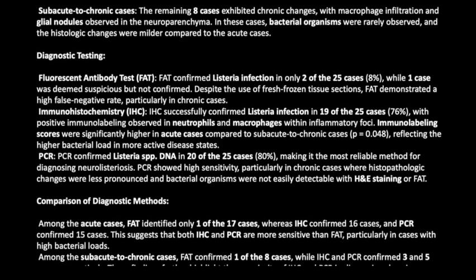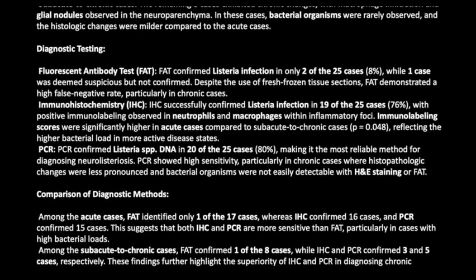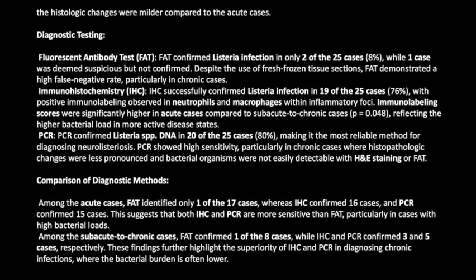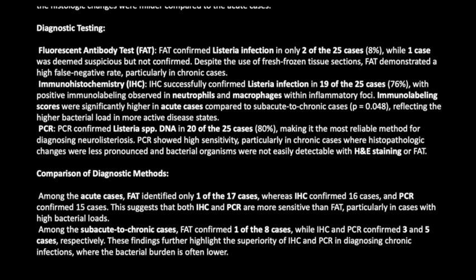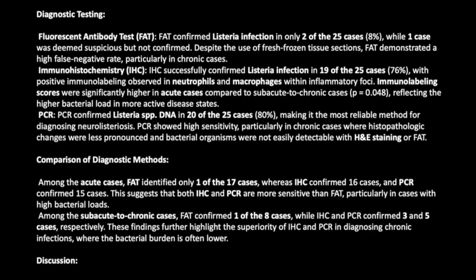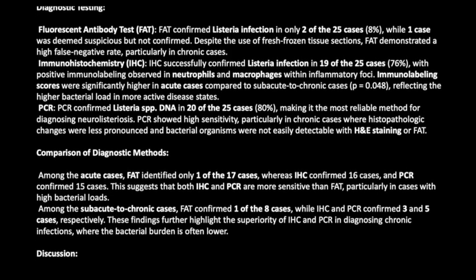PCR confirmed Listeria spp. DNA in 20 of the 25 cases, 80%, making it the most reliable method for diagnosing neurolisteriosis. PCR showed high sensitivity, particularly in chronic cases where histopathologic changes were less pronounced and bacterial organisms were not easily detectable with H&E staining or FAT.